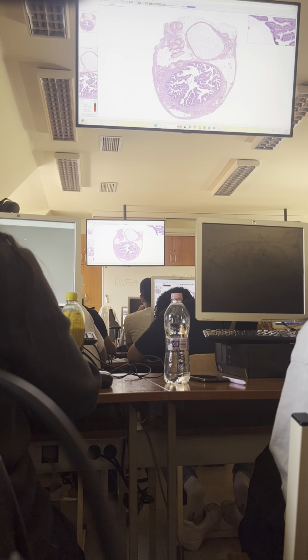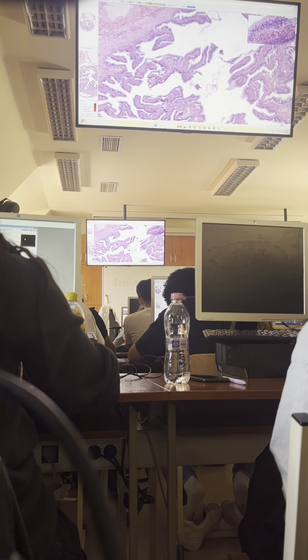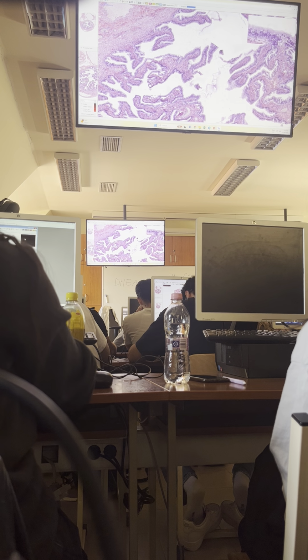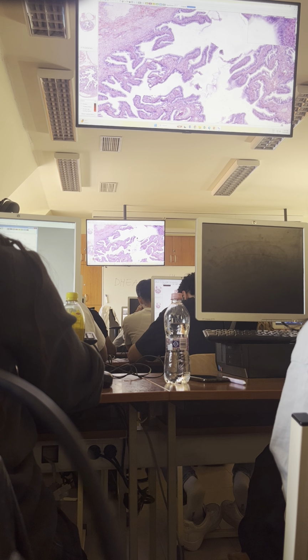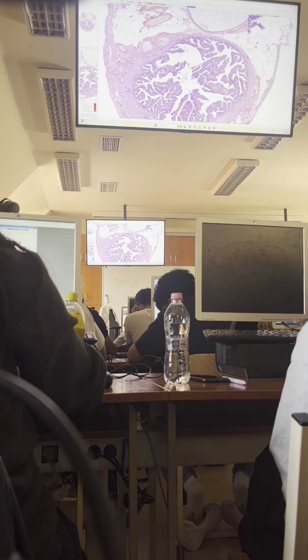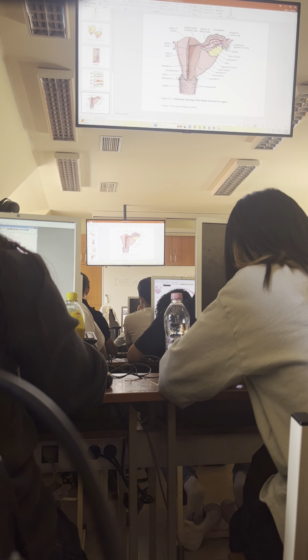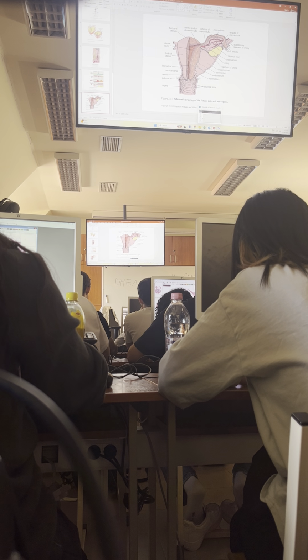And because the mucosa is highly labyrinthic, the border of the lumen is irregular. We can conclude that this sample was probably taken from the ampulla. This is one region of the uterine tube, for which this very labyrinthic appearance is characteristic.